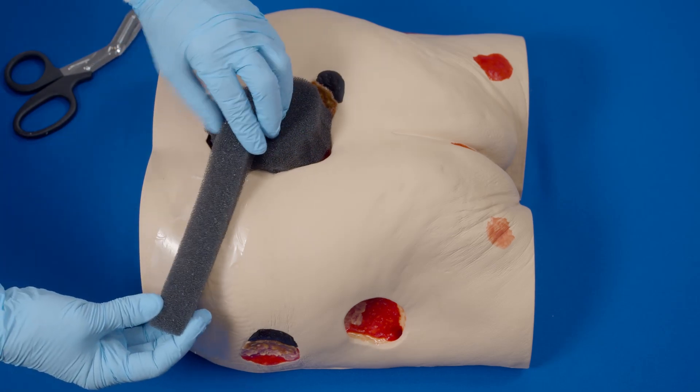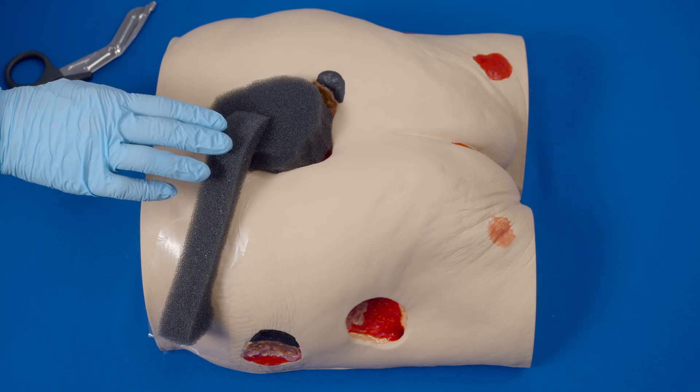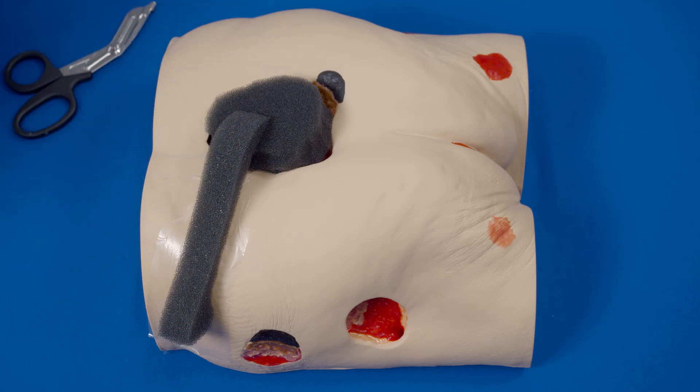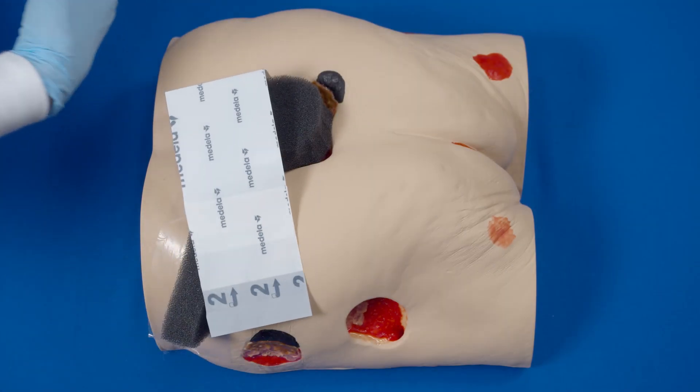Apply the bridge on the transparent film between the wound and the relocation site. Ensure it has good contact with the foam in the wound and has no contact with skin that is not protected. Apply transparent film to cover all of the foam: wound, wound bridge, and relocation site.